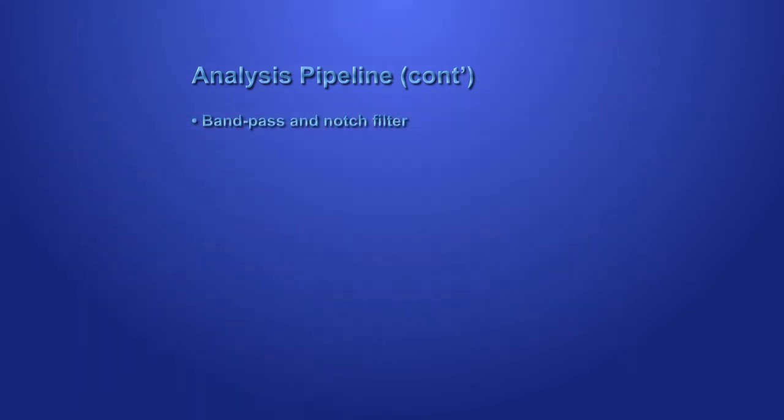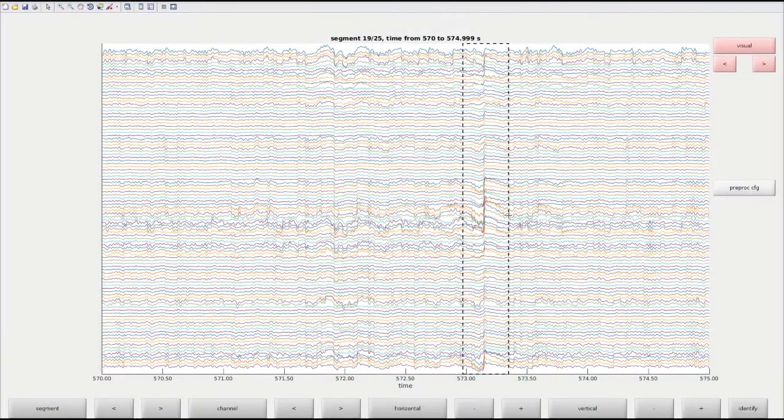The rest of the processing pipeline involves the use of MATLAB and FieldTrip for analysis. Bandpass and notch filtering is applied to both the MEG and EEG data to focus analysis on the frequency band of interest. Time periods in the data containing artifacts are rejected based on visual inspection, in addition to removing periods involving excessive head movement changes.